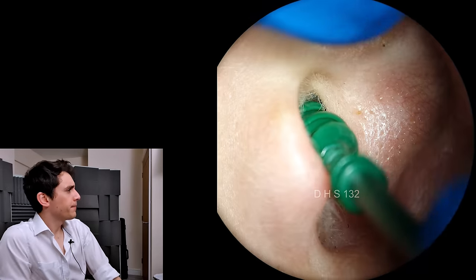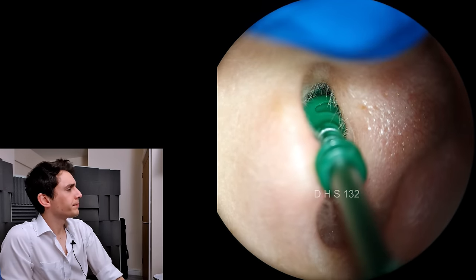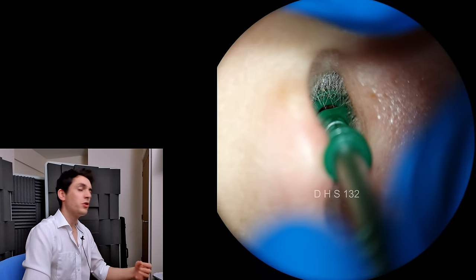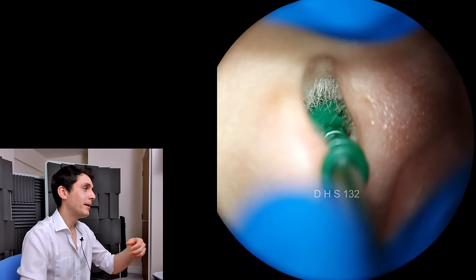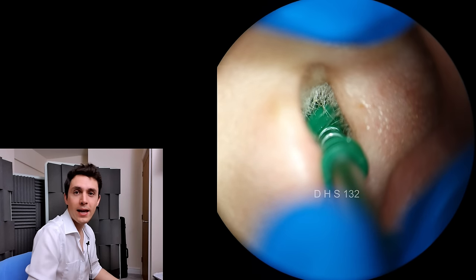I'm going to go in again and advance it clockwise. Prior to sitting him in front of the microscope, I did go in with an endoscope and suction, which is what I normally tend to do. Upon tapping on the wax with a Zollner probe, I just knew it was going to be perhaps a little bit of a fight to get it out with suction.